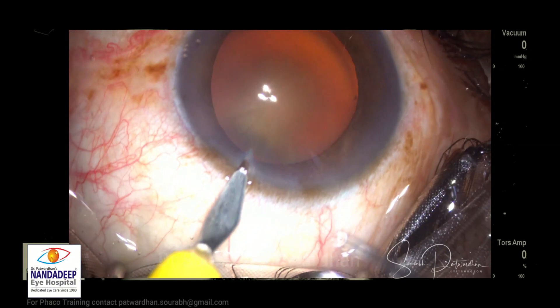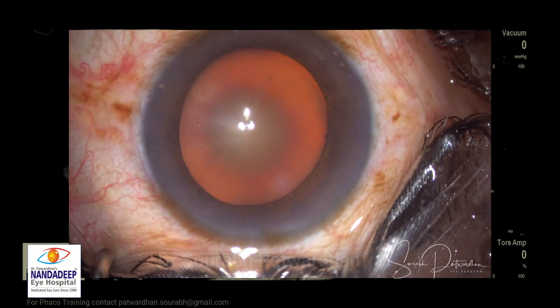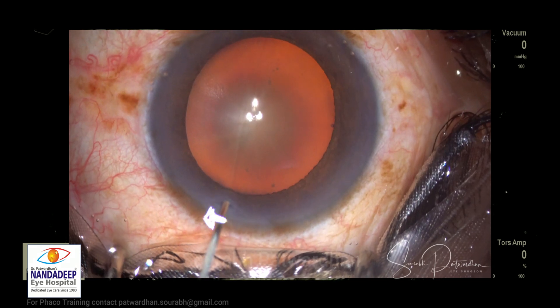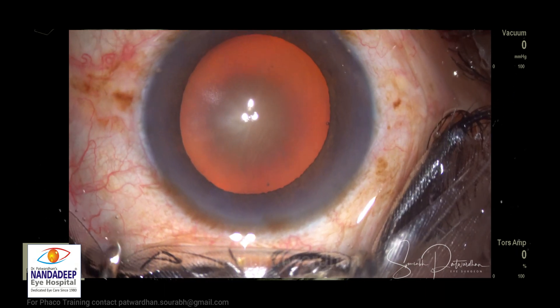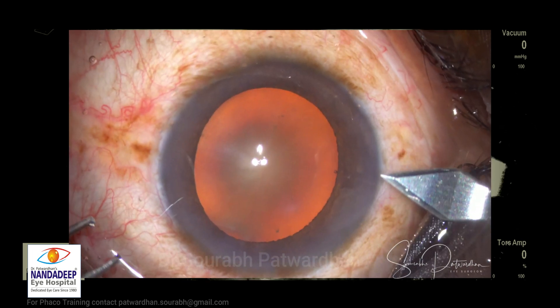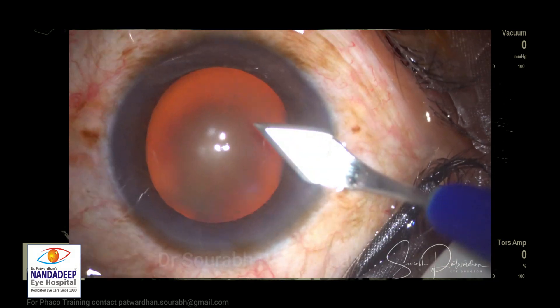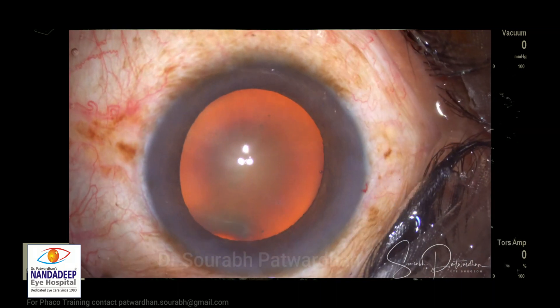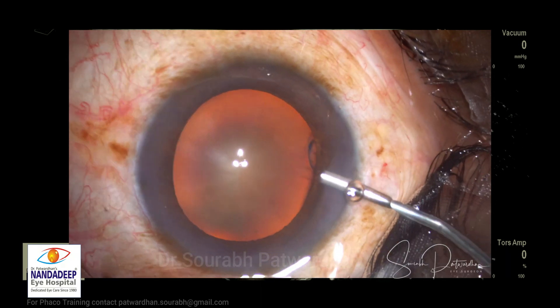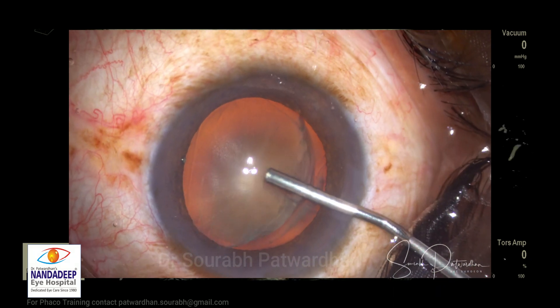On the right side you can see the vacuum, torsional amplitude, and also FACO parameters will be shown on the left side. There will be irrigation pressure shown as well. This is a case of a high myopia patient and you can see the nuclear sclerosis — a dense cataract grade three to four. I am planning to do half trench followed by chop, which I call half trench chop. That is my preferred method for these kinds of dense cataracts.